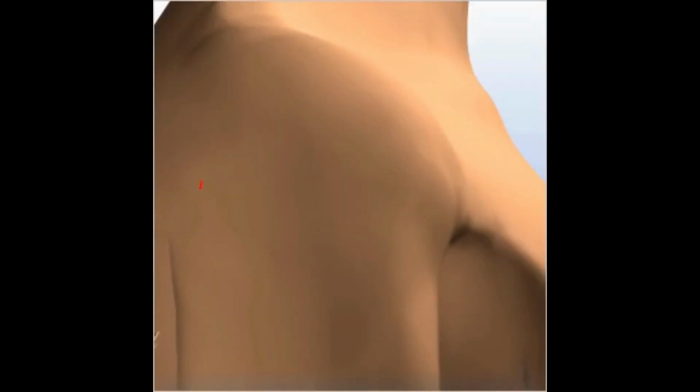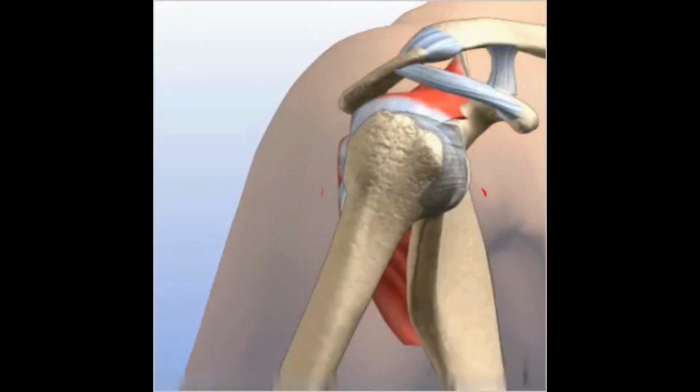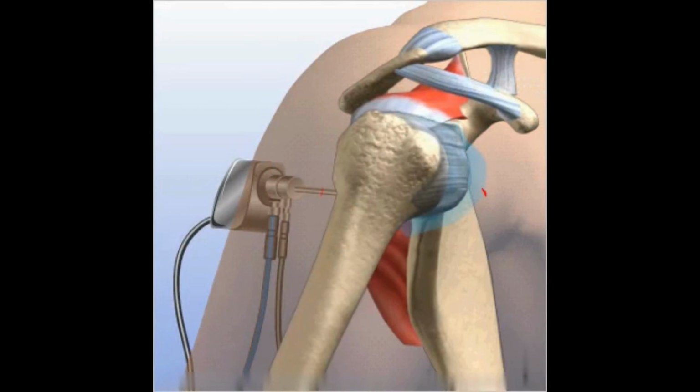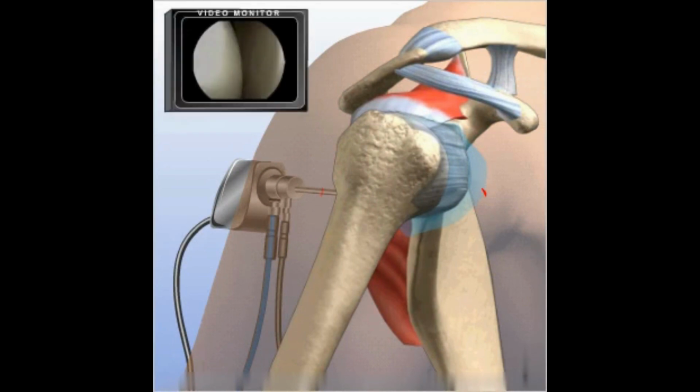Small incisions are made around the joint. The scope and surgical instruments will go into these incisions. The scope is inserted into the back of the shoulder joint. Saline solution flows through a tube and into the shoulder capsule to expand the joint and to improve visualization. The image is sent to a video monitor where the surgeon can see inside the joint.